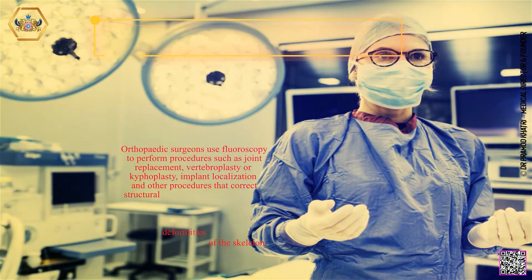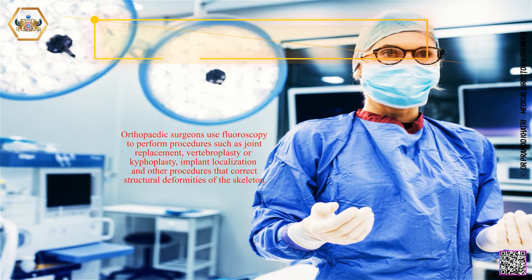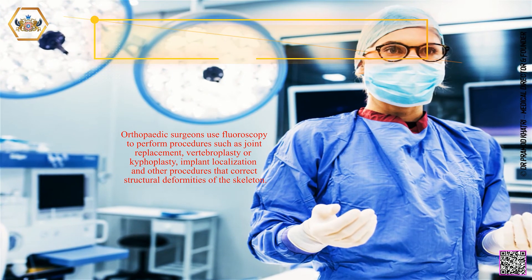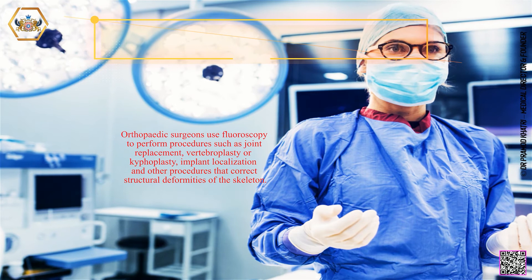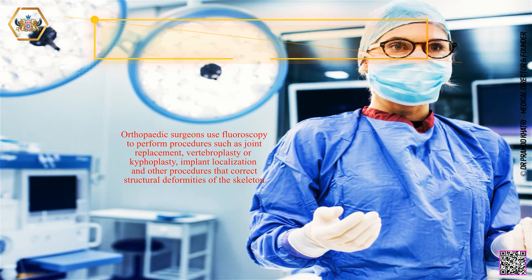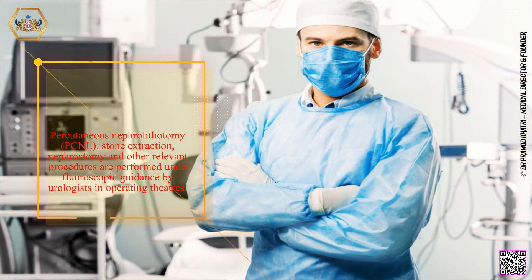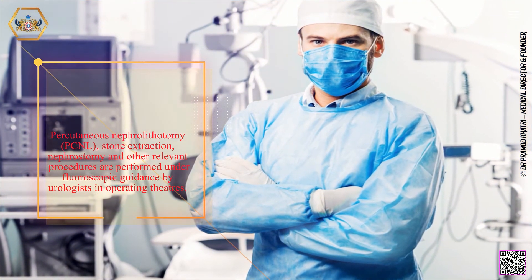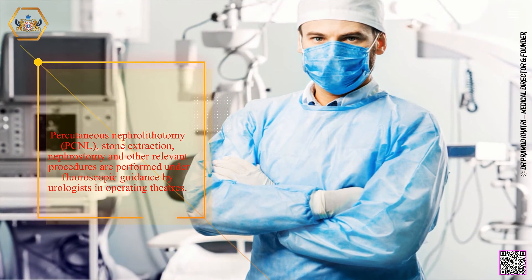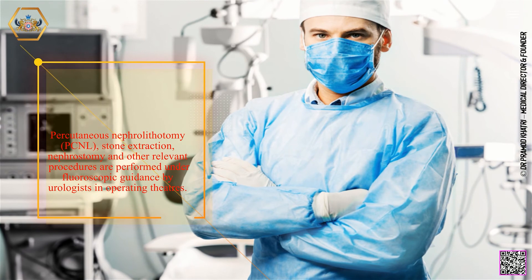Orthopaedic surgeons use fluoroscopy to perform procedures such as joint replacement, vertebroplasty, kyphoplasty, implant localisation, and other procedures that correct structural deformities of the skeleton. For percutaneous nephrolithotomy (PCNL), stone extraction, nephrostomy, and other relevant procedures, fluoroscopic guidance is used by urologists in operating theatres.